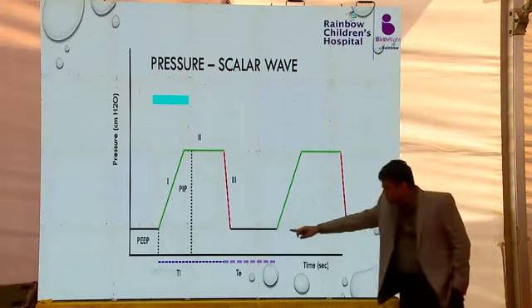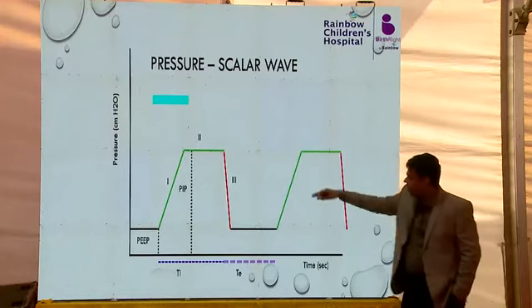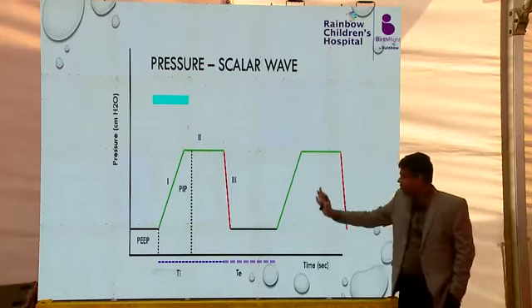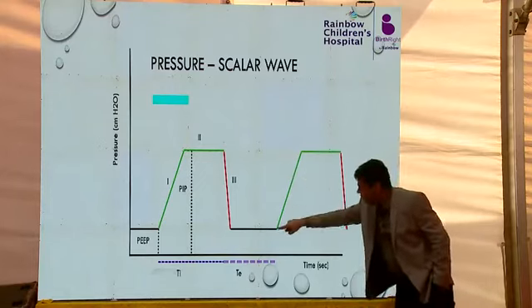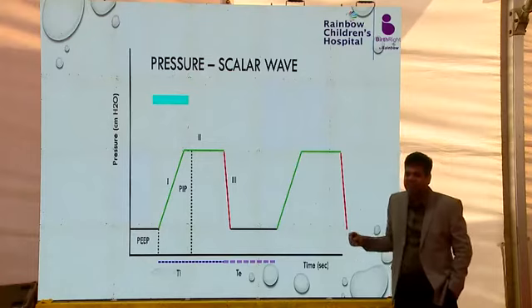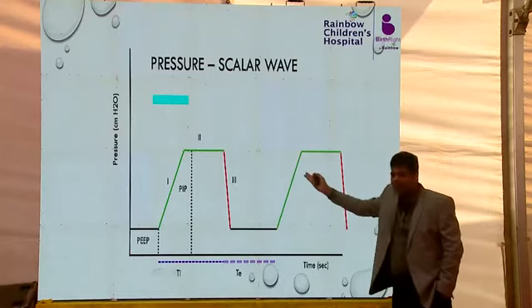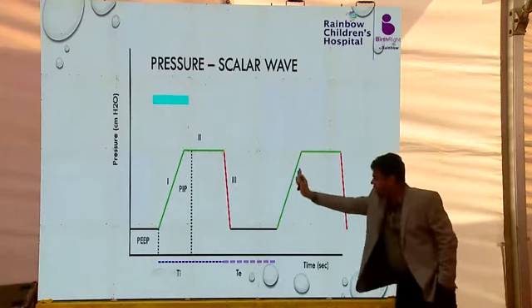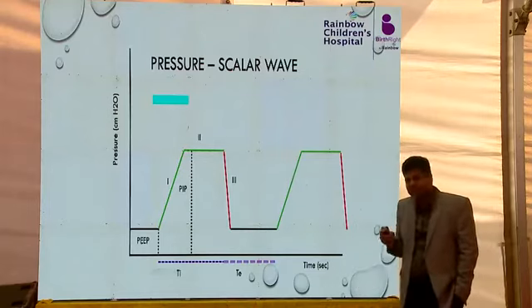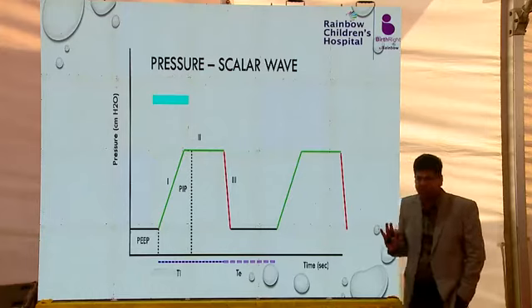So first and foremost, you can lift up the baseline by increasing the PEEP. Okay. Then you can lift up this thing by increasing the PIP. Then third is you can try to achieve this PIP earlier. So if this line is like this, one is like this, and one is like this, which one is achieving earlier? When the slant is lesser, you will increase the area, and you can shift this line here by increasing the flow. There are some ventilators in which you adjust the flows, but there are some ventilators nowadays in which you cannot adjust the flow, the machine is only doing the job.